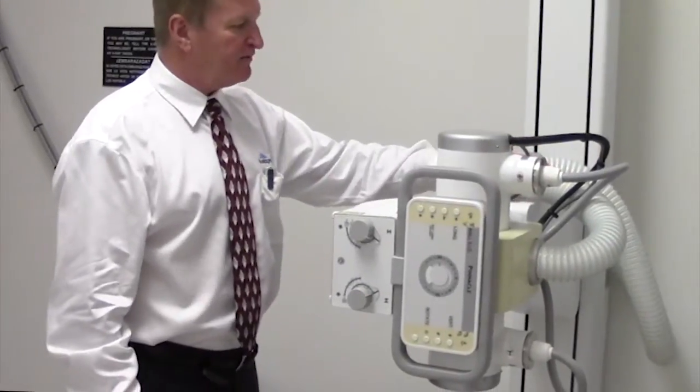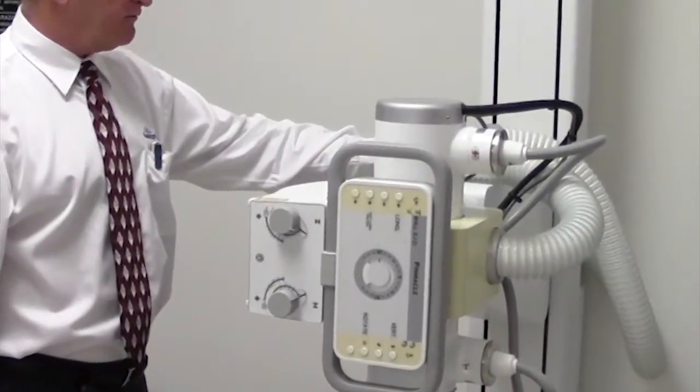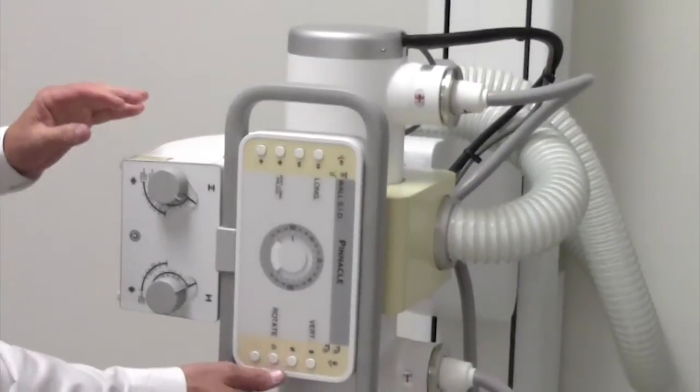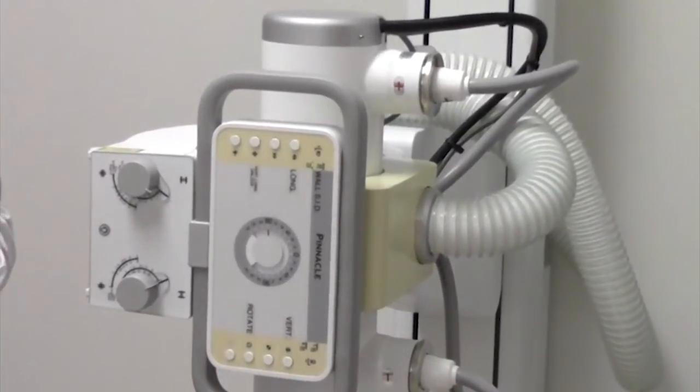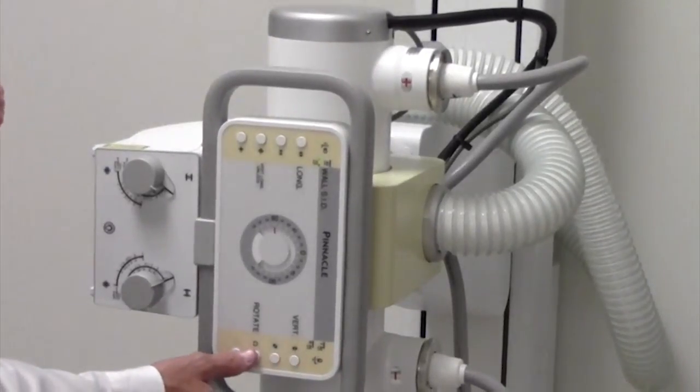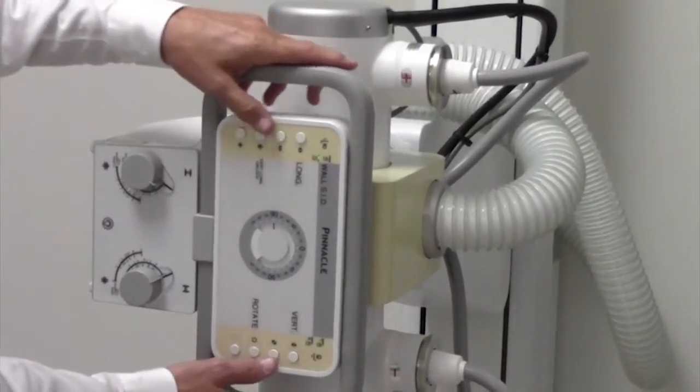The tube stand has all the cabling encased in our cable concealment system. Electronic locks that are on when the power goes off for safety. Longitudinal vertical rotation locks are all very conveniently located.